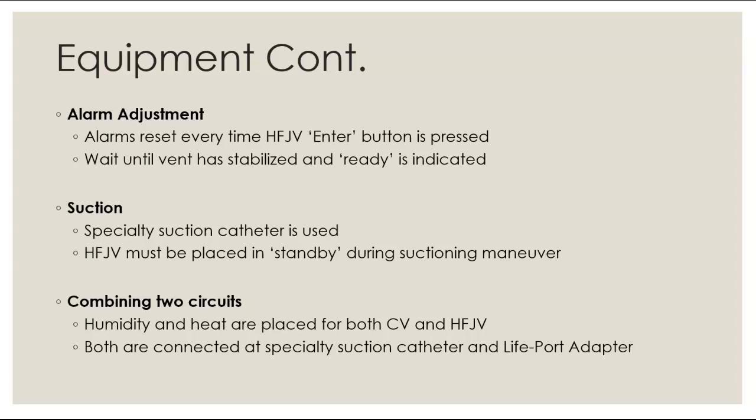And we have that specialty suction catheter, and you would just use the same strategy. You would match the numbers on your suction catheter up with the one on your endotracheal tube. The jet has to be placed in standby for the suction maneuver, or else it will cause the ventilator to kind of freak out, and then you don't get as appropriate of suction.